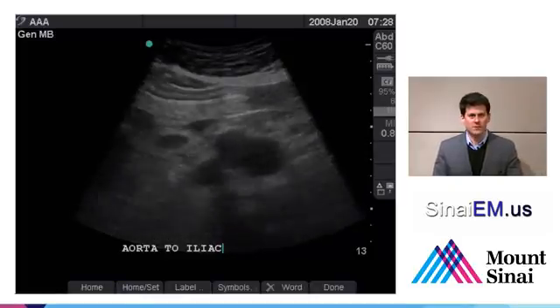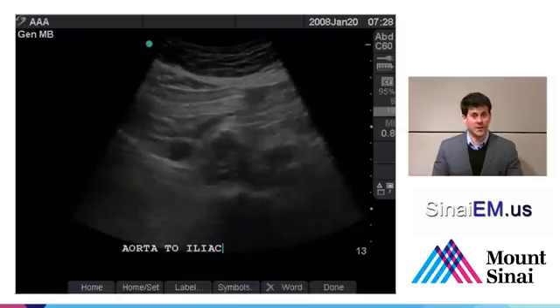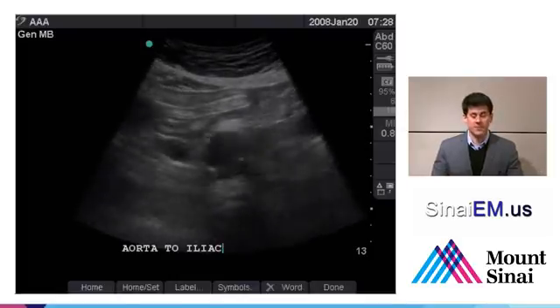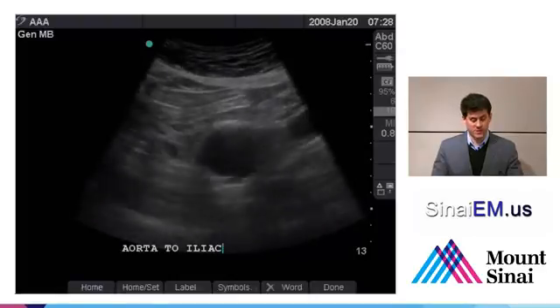So the differential included neurologic as well as arterial processes going on, and the point-of-care ultrasound greatly expedited their care, and the consultation with vascular surgery and obtaining some more definitive imaging and moving this patient forward in their care in the emergency department.